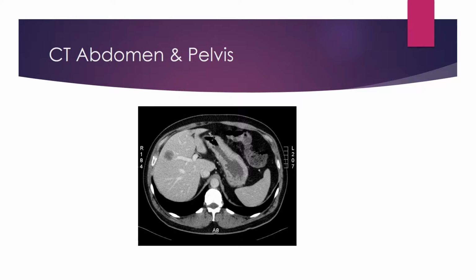The scan here shows a mass, a tumor, which was approximated to be 4 to 5 centimeters in diameter and was localized. To identify the nature of the tumor, whether it is benign or malignant, a liver biopsy was done, which confirmed that the tumor was malignant.